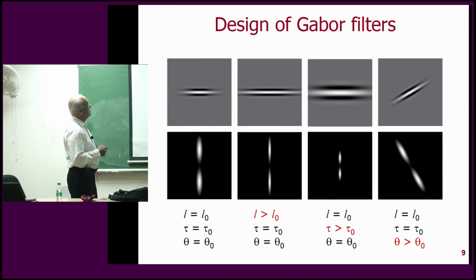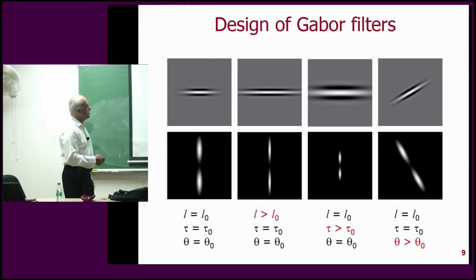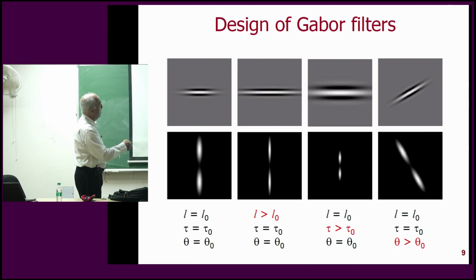Okay. Those topics I have already discussed, I'll mention briefly. So here is a Gabor function oriented horizontally. Its frequency response is here: impulse response in XY, frequency response in U, horizontal frequency, V, vertical frequency, DC in the middle. So it's a bandpass filter oriented at 90 degrees in the frequency space, or 0 in the image space.